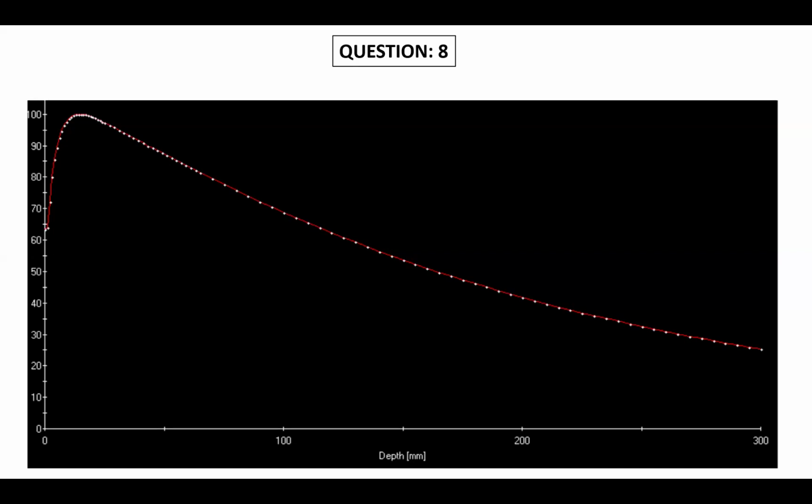What is PDD, madam? Define PDD, percentage depth dose. Sir, it's a percentage ratio of the dose absorbed at any given point to the reference depth on the central axis, sir. The reference here is completely Dmax. What is the percentage of dose at any point with respect to Dmax? Simply, can you tell me what is PDD in simple layman language? Percentage of dose at various depths with respect to Dmax, sir.